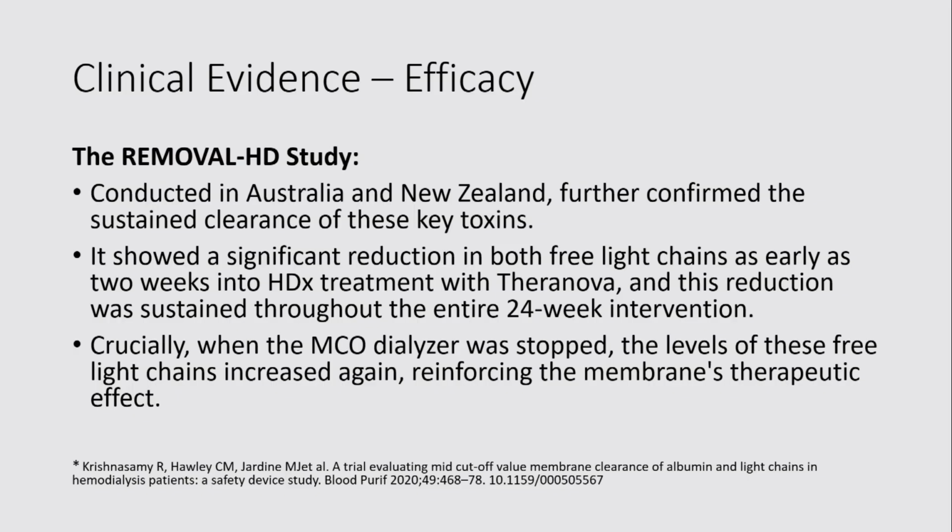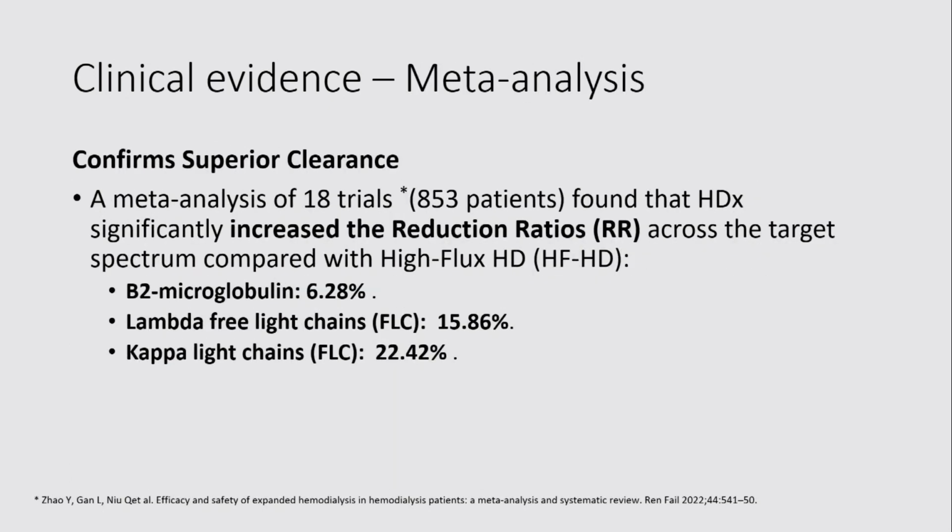And when this membrane use was stopped after 24 weeks, these levels again started rising. So this reinforces the membrane's therapeutic effect. Coming to meta-analysis, all studies have also confirmed there is superior clearance of larger middle molecules with the use of expanded hemodialysis as compared to high flux hemodialysis.